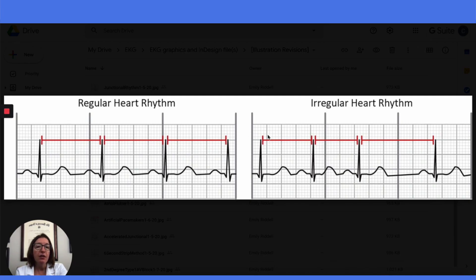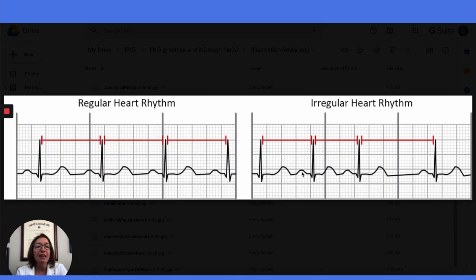As opposed to this graphic on the right, you can see when we measure the distance between the R waves that they vary. This is a smaller distance between this R wave and this R wave than it is between these two R waves, so this would have an irregular ventricular heart rhythm. To analyze the atrial heart rhythm, we would do the same thing with calipers, but measure between the P waves to see if the distance between each P wave is equal or if it varies. In this case, we have an irregular ventricular heart rhythm as well as an irregular atrial rhythm.